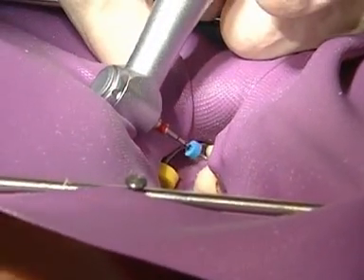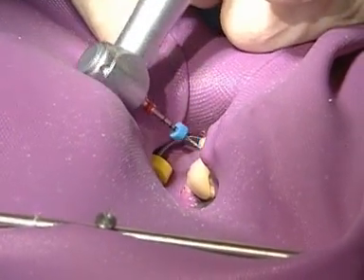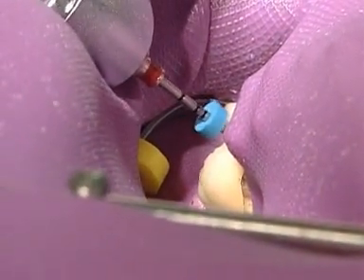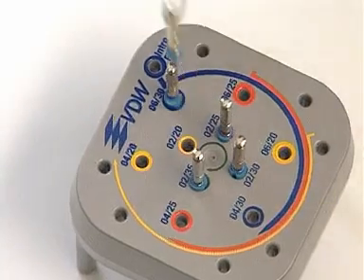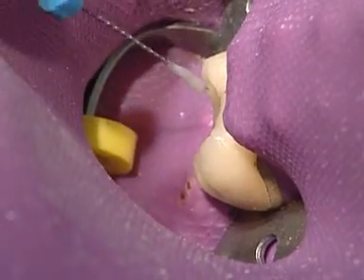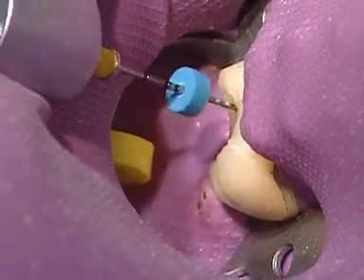If full working length has been reached with this instrument, apical enlargement can begin with the taper 02 instrument in the next largest size, that is an ISO 30. If full working length has not been reached with an 0425, taper 02 instruments in continuously decreasing ISO sizes should be used until the apex has been reached. In this case, the next instrument would be an 0220. When full working length has been reached, the crown-down phase has been completed.